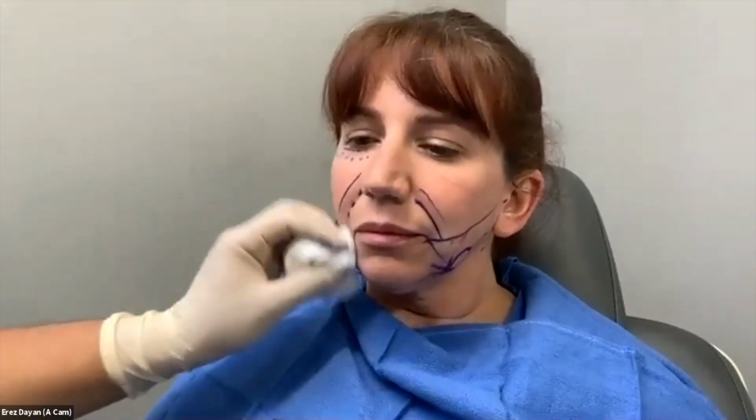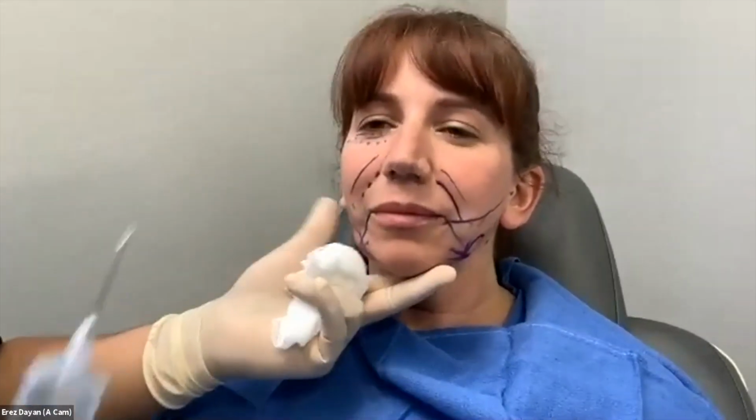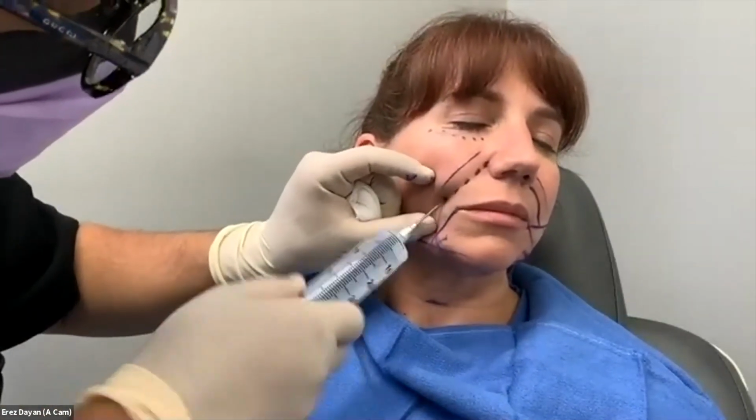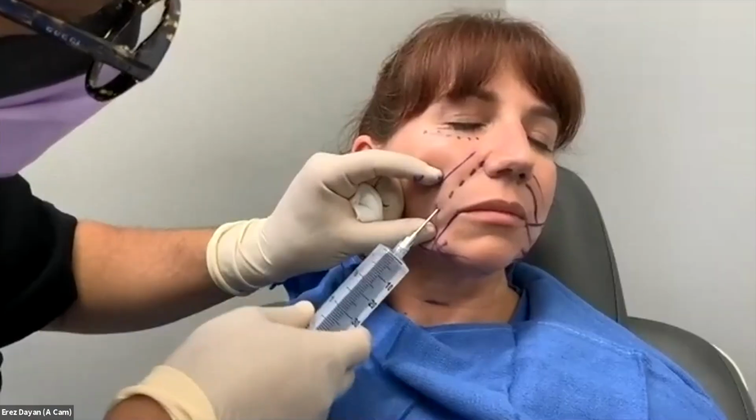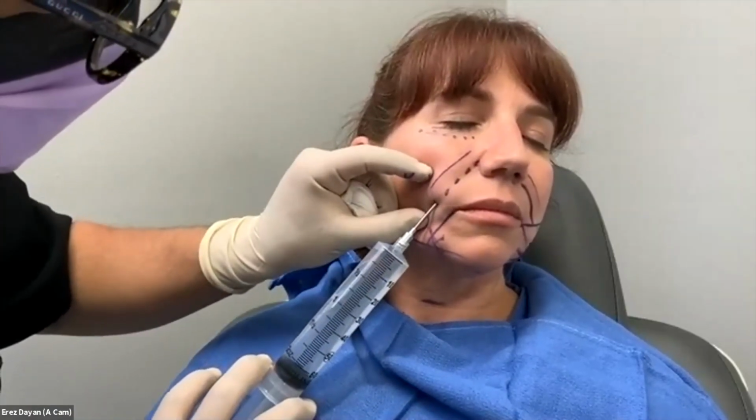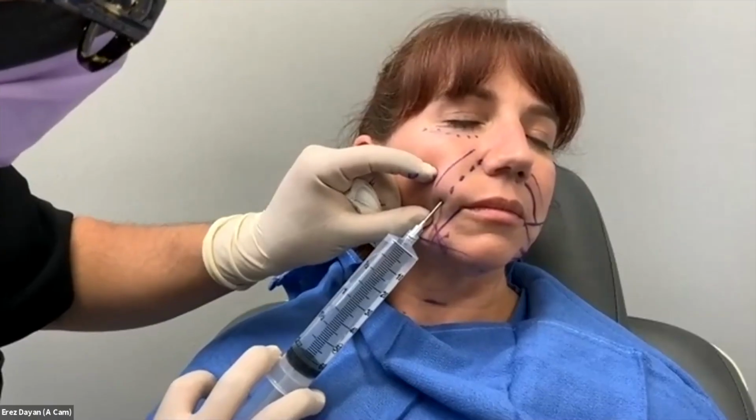So in this case, I'm going to just do it with the 18 gauge because it's such a small area. I don't really need a whole tumescent cannula setup. Are you going to give me dimples? Let me have you look that way. So here's my little poke. So I'm just kind of going in. And then I'm just going to slowly infiltrate on my way up. It's not very much. It goes in pretty easy.